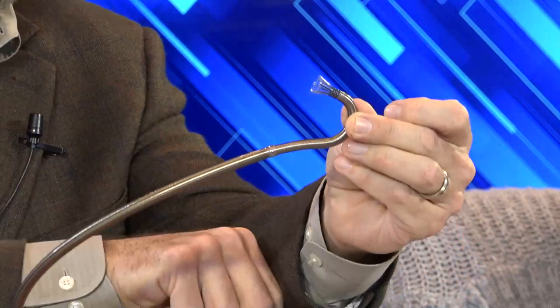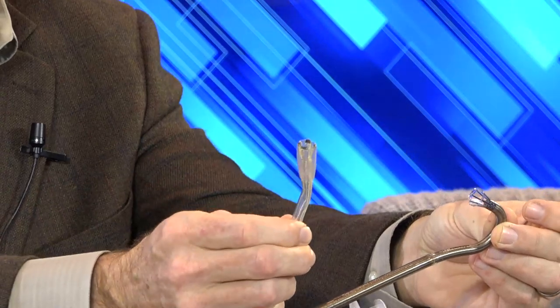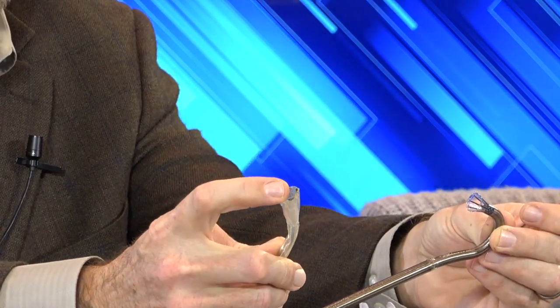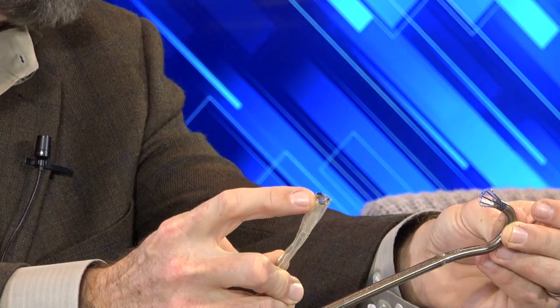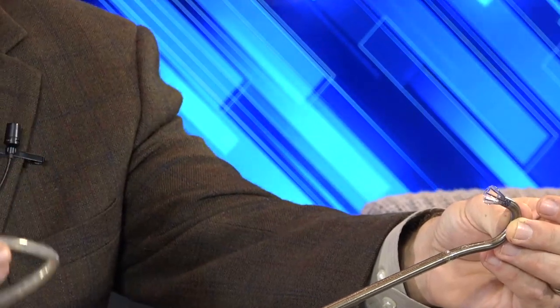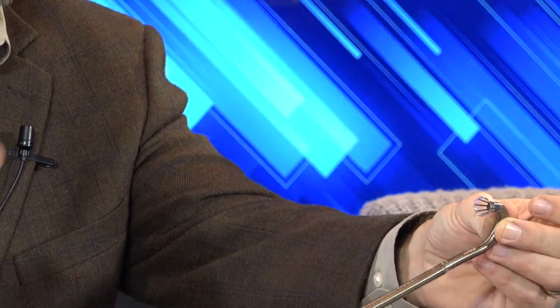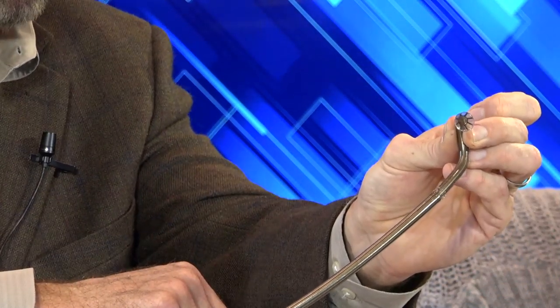One of the challenges that we had with some of the cases that were done with our Gen 2 cannula was that as you inflated the balloon, some of the petals wouldn't expand all the way. This would create an area where a petal could actually prolapse in, and with it prolapsing in, you would have an effect on flow rates and the ability to extract material. Now, there is a nitinol basket on the inside of here. That funnel is the same every time, and it's 14 millimeters.